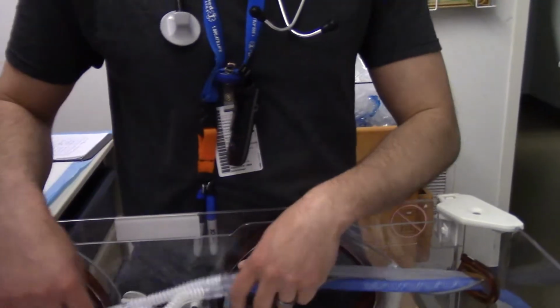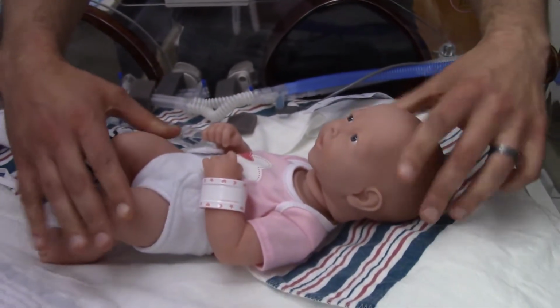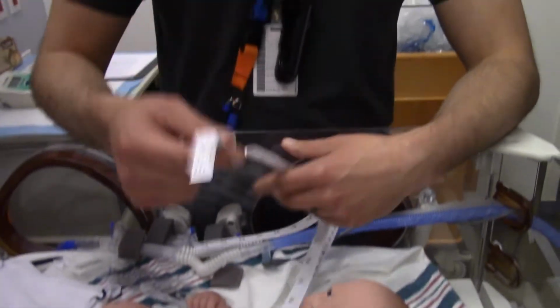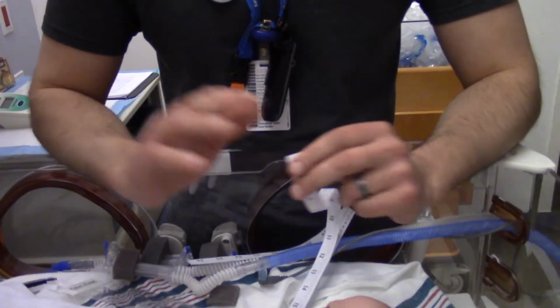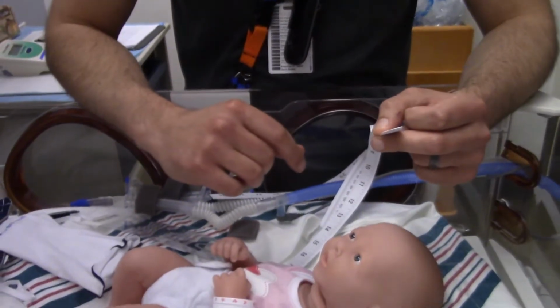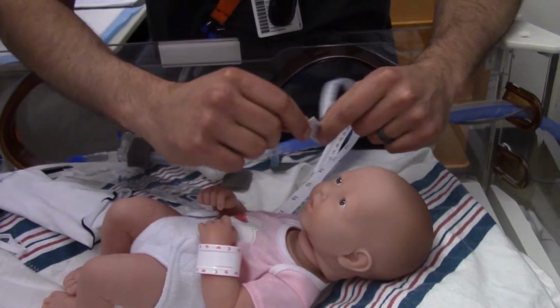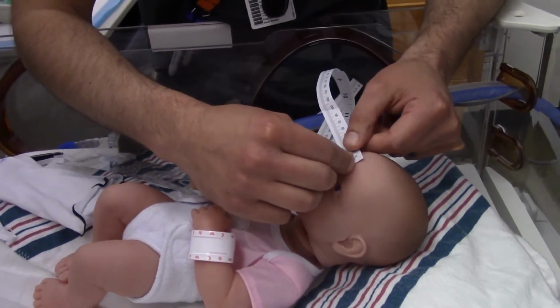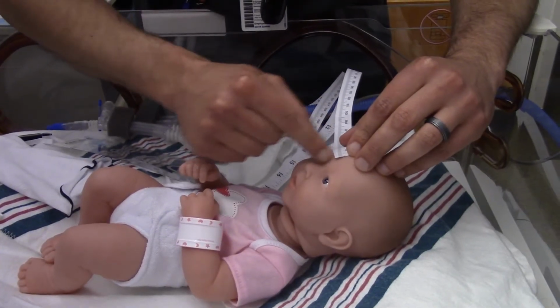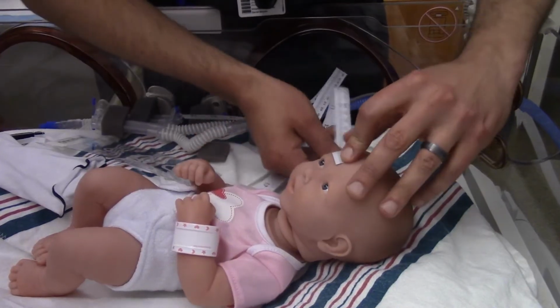So next step. Baby comes in from the delivery room, gets sat down, okay? The RT or nurse, the OFC is important, right? So when we're putting a baby on bubble CPAP, it is a shared responsibility of getting the OFC. And that's kind of our initial go-to. So when we're doing this for bubble CPAP, we want to try to make sure that we are midline, right above the septum, midline of the forehead there, come around.